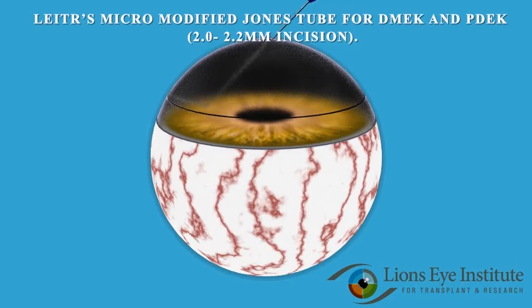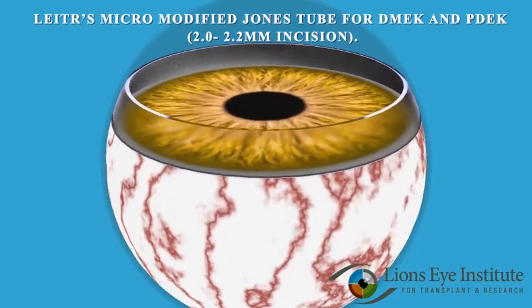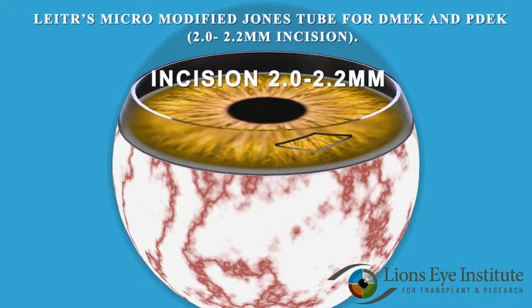After recipient preparation, the narrow end of the tube is inserted into the recipient's anterior chamber through a 2.0 to 2.2 millimeter incision.